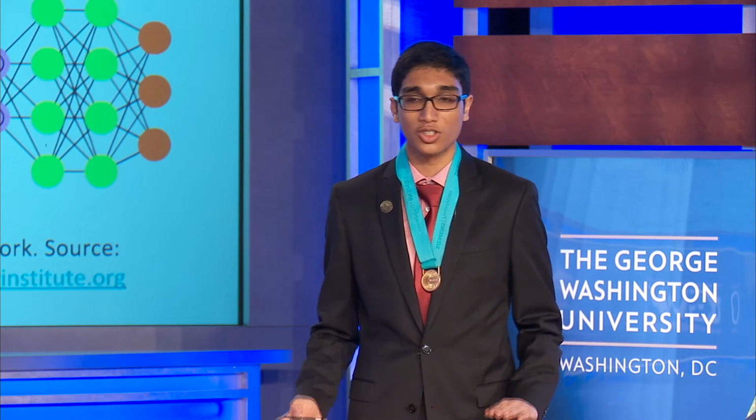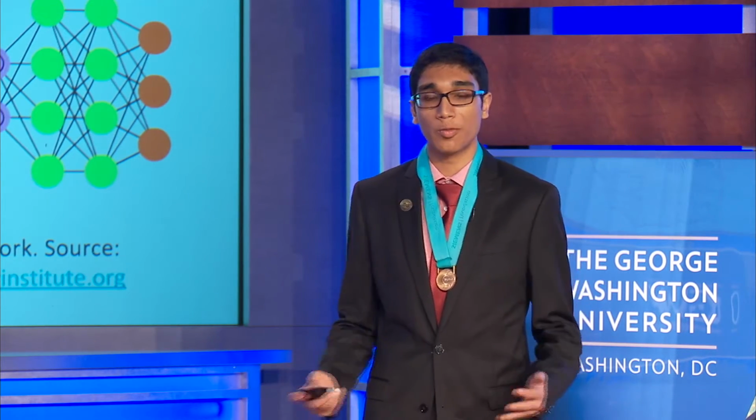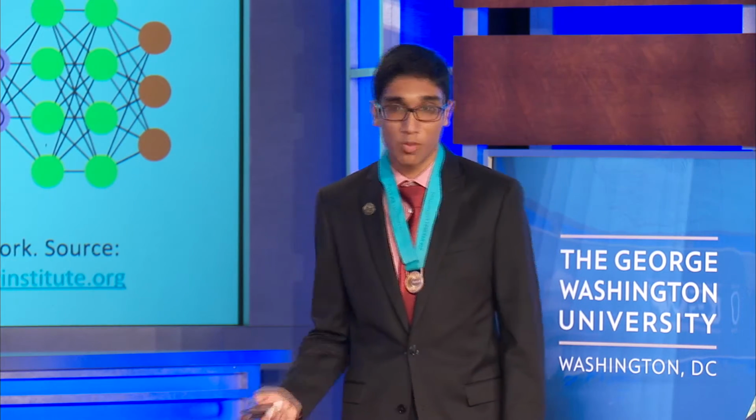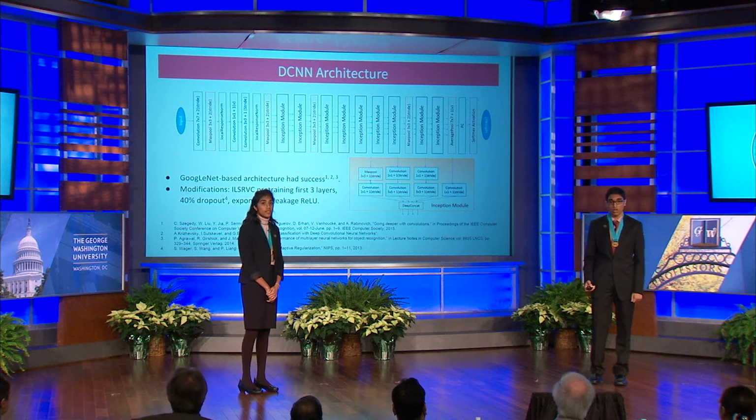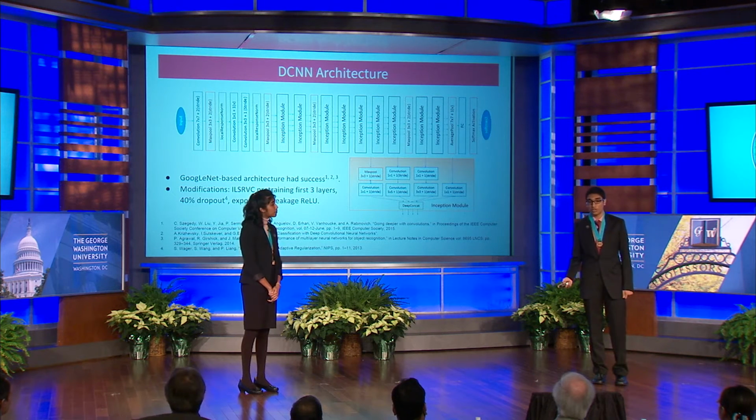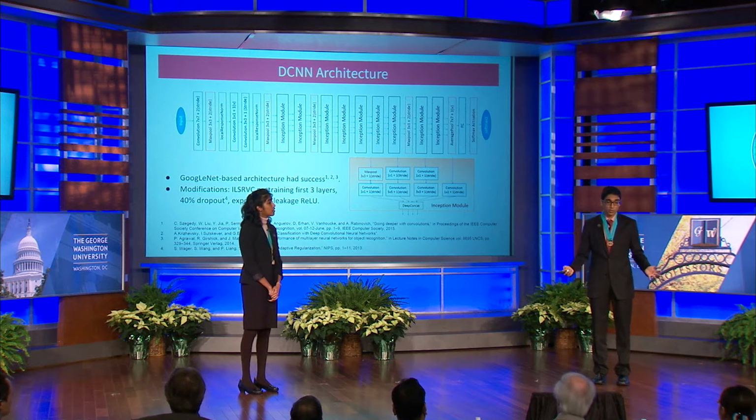As we discussed earlier, previous research used deep convolutional neural networks to model mitotic regions, but we felt they didn't go deep enough. Deep learning is this new paradigm that's changing the face of machine learning. It's this idea that by using large interconnected networks of neurons that signal to each other, it's possible to model high-level abstractions and achieve great success on tasks like image classification and scene recognition. GoogleNet is one such deep learning model, and we built a GoogleNet with some crucial modifications and trained it to predict for each pixel whether it was inside a mitotic region, given a 139 by 139 window of context.